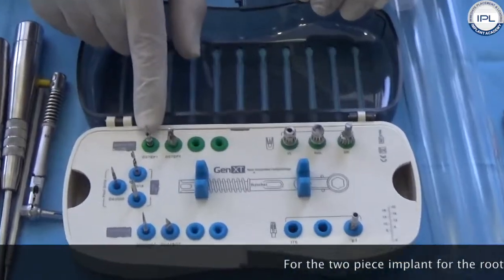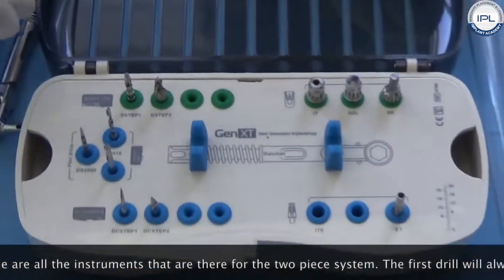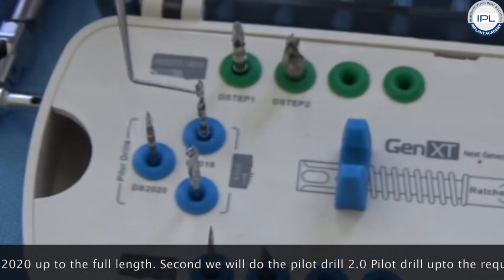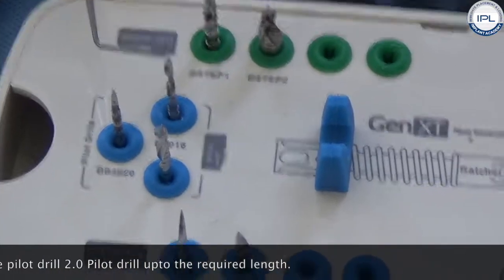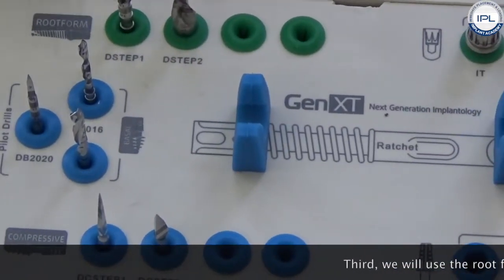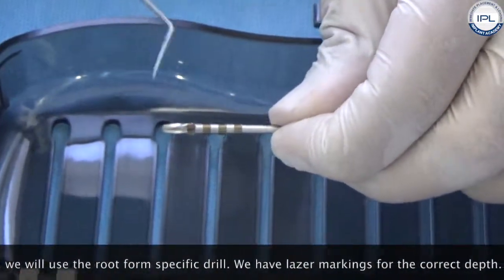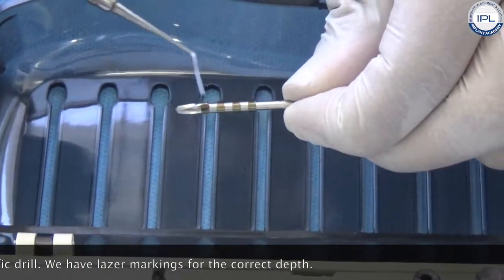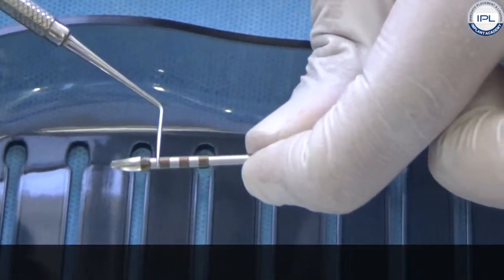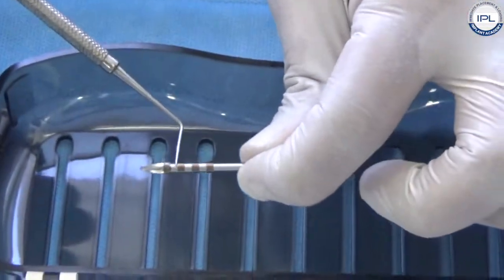For the two-piece implant root form, these are all the instruments for the two-piece system. The first drill will always be the DB 2020 up to the full length. Second, we will do the pilot drill 2.0 up to the required length. Third, we will use the root form specific drill — this drill has laser markings to indicate the correct depth. So: full length DB 2020, full length 2mm pilot drill, and full length D-step 1.